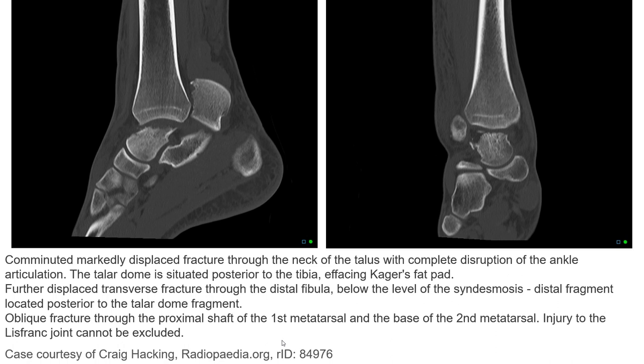This CT shows a markedly displaced fracture through the neck of the talus with complete disruption of the ankle articulation. The talar fragment is situated posterior to the tibia, effacing Kager's fat pad. There is a displaced transverse fracture through the distal fibula below the level of the syndesmosis, and oblique fractures through the proximal shaft of the first metatarsal and the base of the second metatarsal. Injury to the Lisfranc joint cannot be excluded.